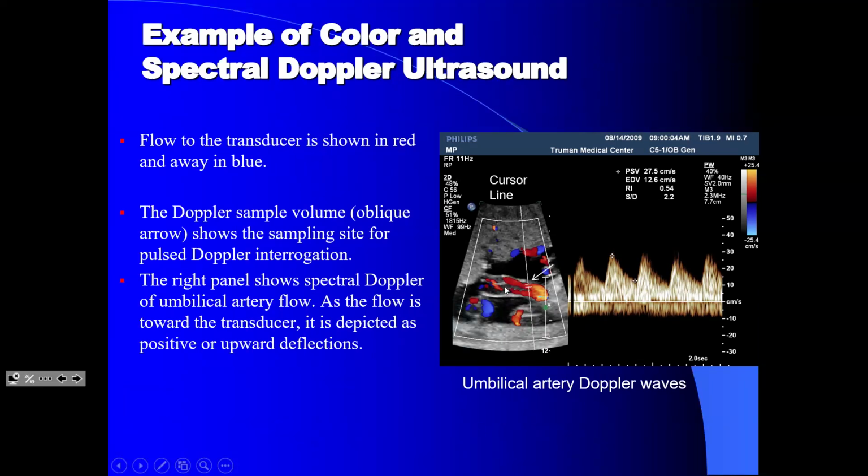So the vein and the artery are studied with the help of Doppler like this. So this is the arterial waveform. Why is it important? Because this tells us whether the blood supply to the fetus is normal or abnormal. If you have a waveform like this, where you have a diastolic component, you see this is the diastolic component and this is the systolic component. The upper part is the systolic, and this is the diastolic component.